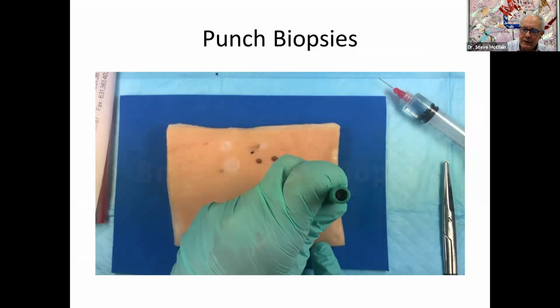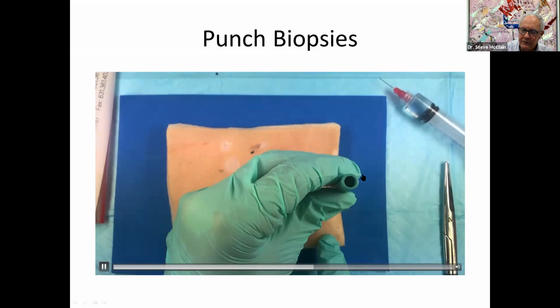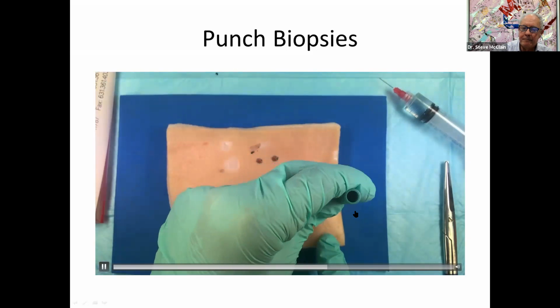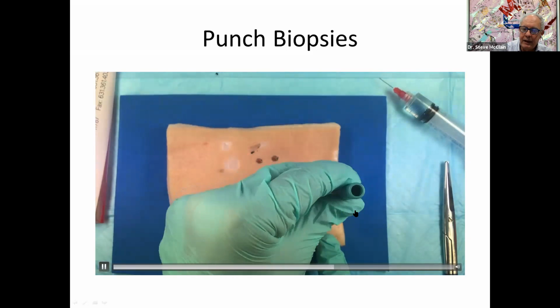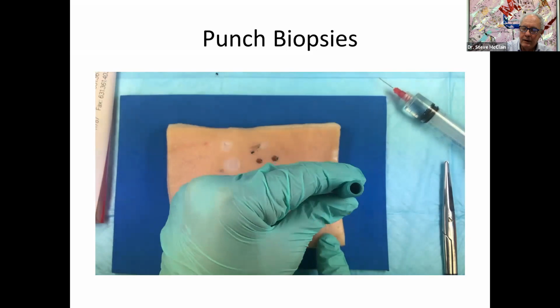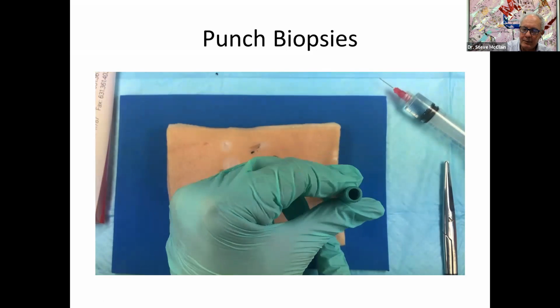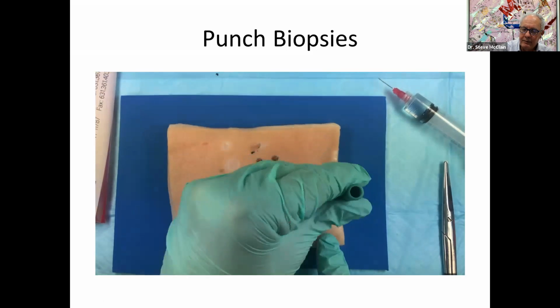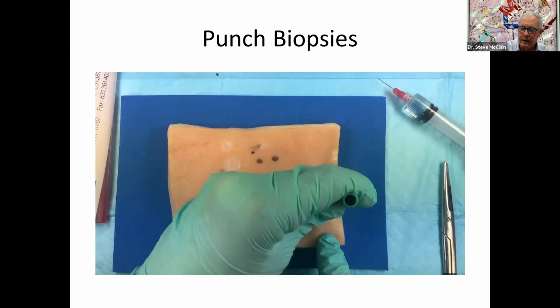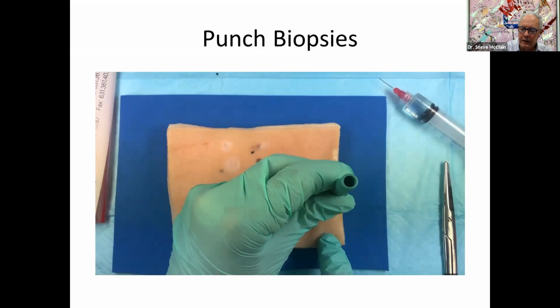Here's a larger punch. And this model actually has a hole all the way through. I don't know if you can see that. I didn't know that. This is an 8 millimeter punch. It's going to go all the way down. Now you can try and tilt it, but an 8 is really hard to cut off the base. Same slicing, tilt, but turn 1/4 turn back and forth until you get it all the way.